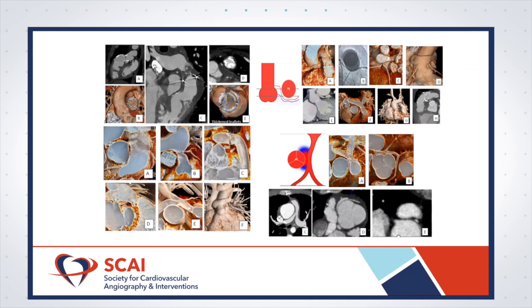If the coronary courses between the aorta and the pulmonary artery, that's very important. If it comes off high in the aorta and has to go below the pulmonary valve, I think that's important. And I also think the location of where your landing zone is.